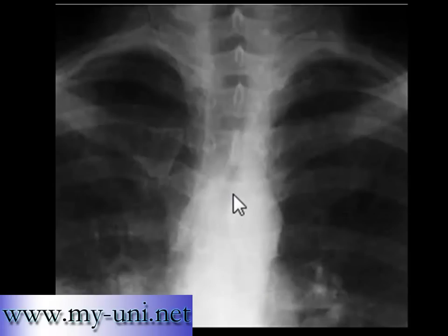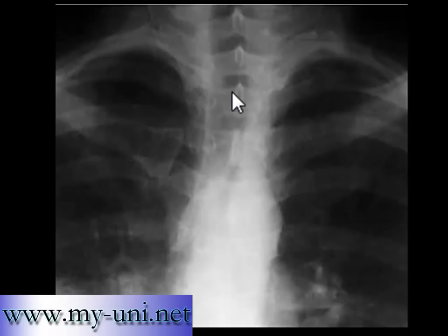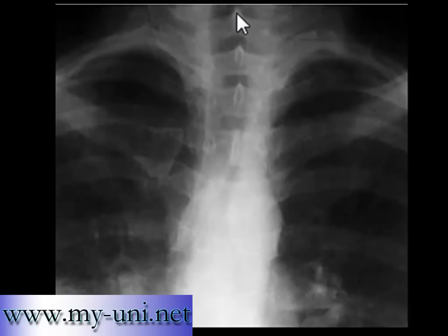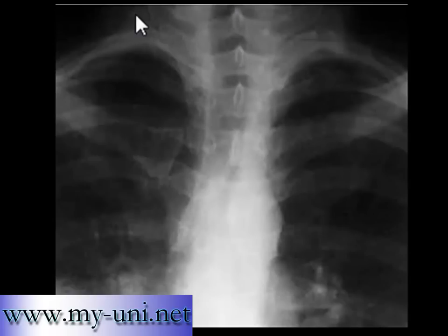Pay attention to this thin opaque line extending from the right lateral side of the trachea at the level of the third thoracic vertebra. This is the first thoracic vertebra — counting the spinous processes: one, two, three, four. The first rib is attached to the first thoracic vertebra, followed by the second and third thoracic vertebrae.